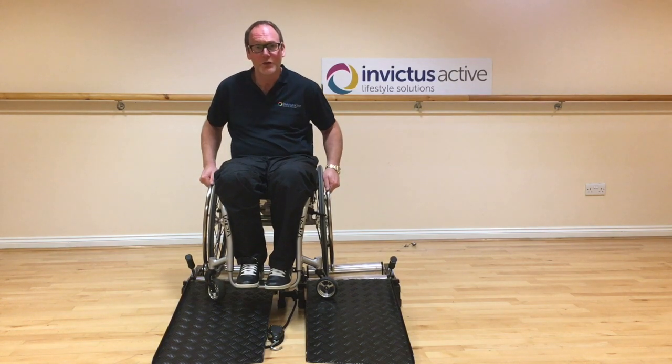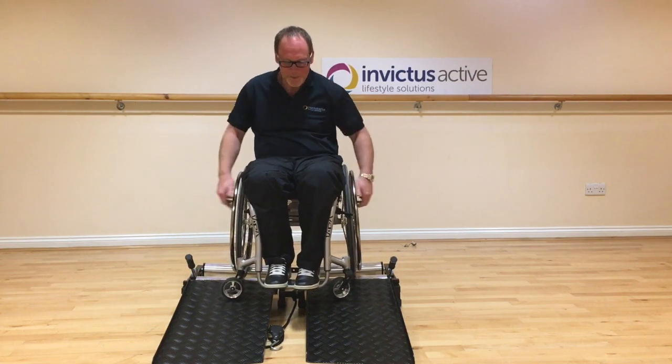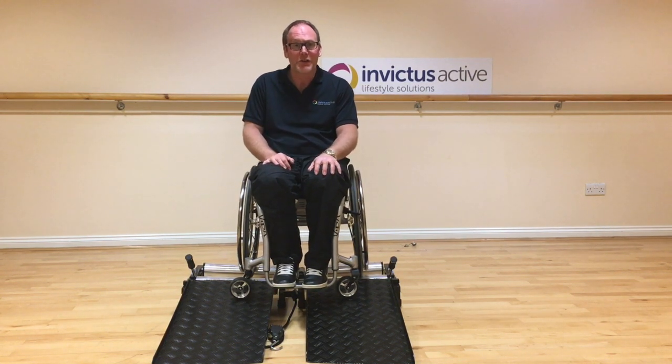And there you go - I've clearly travelled to the right. And just to prove the point, if I wheel backwards, I travel back to the centre of the trainer. So I'm going to show you now how to correct this problem.